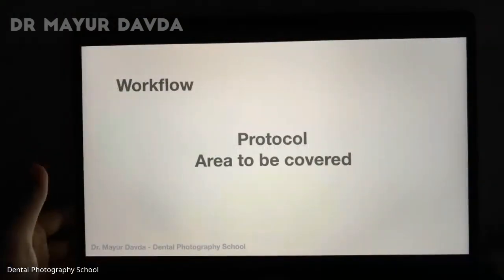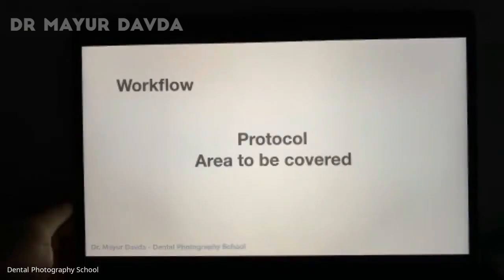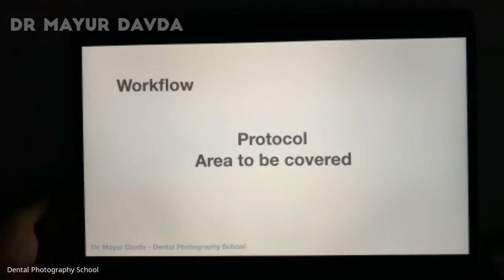Now we need to understand the workflow. All right, that's the last part of our session today. So in the workflow, you have to decide about two things. Are you going to follow any protocol, or you're just going to go ahead and just shoot with respect to the area that you're going to be concerned with?